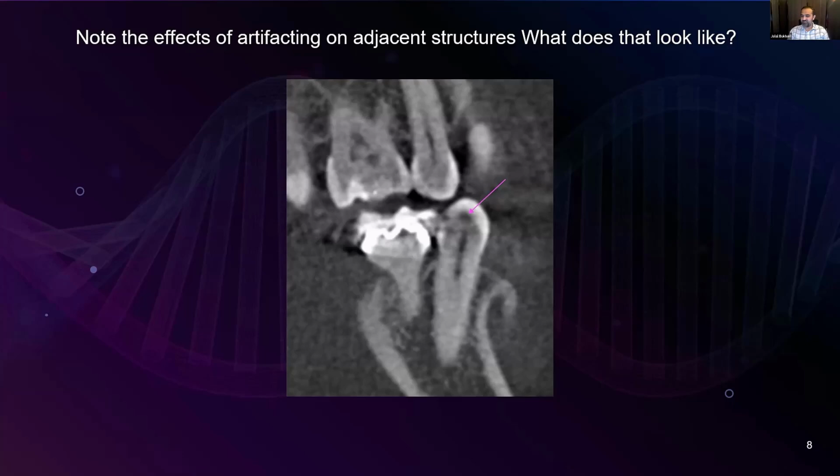For this reason, CBCT imaging is considered suboptimal in the detection of caries, and intraoral imaging and clinical evaluation are still considered the first choices.